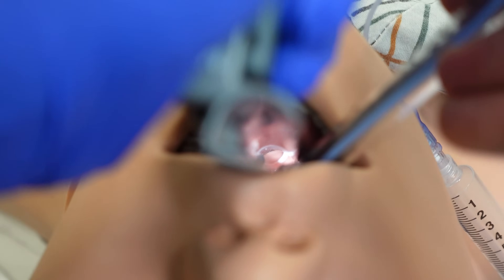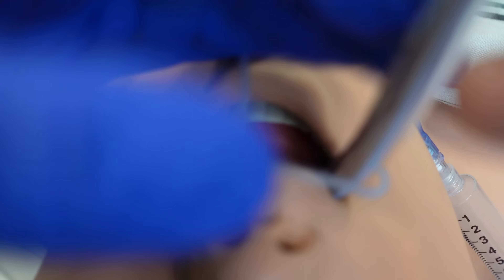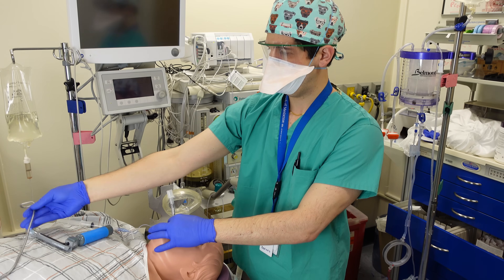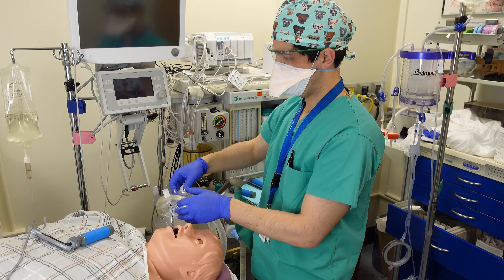As your intubation skills become more advanced, you can start intubating without necessarily seeing all of the vocal cords, or without seeing the vocal cords at all. But as you're just getting started, you should really only be passing the endotracheal tube through vocal cords that you can see directly. Once you've got the cuff of your endotracheal tube past the vocal cords, you can go ahead and remove your stylet, remove your blade, and inflate the endotracheal tube and connect it to your circuit.